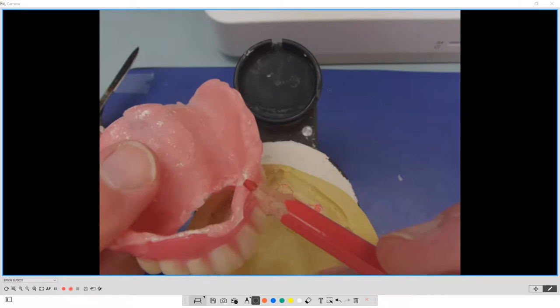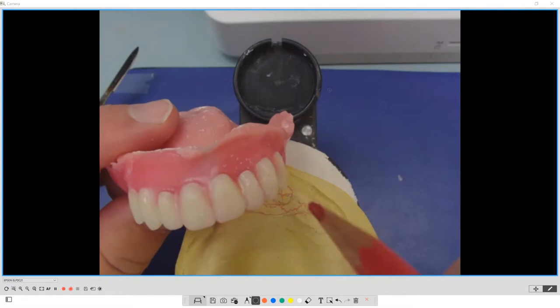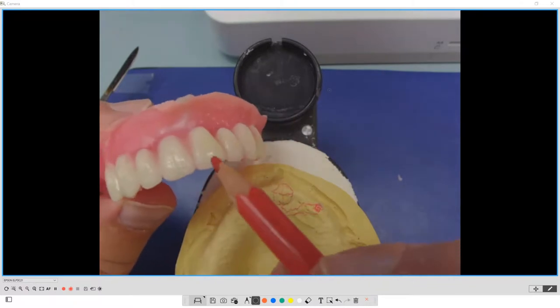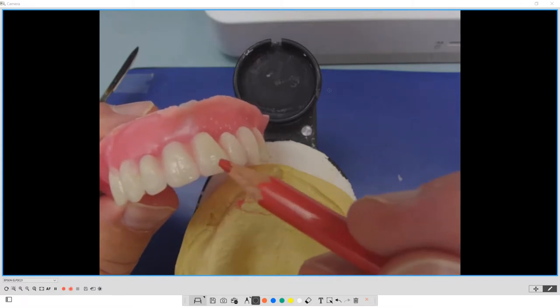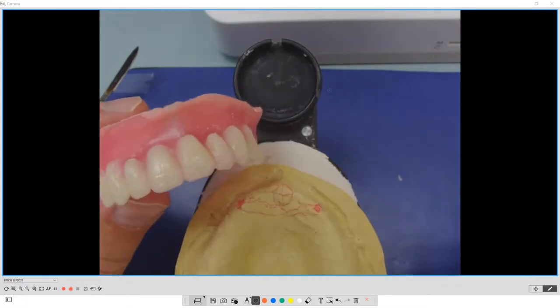So we can actually use the teeth to push the lip more forward on those types of cases, yet do it without making it look Bucky Beaverish, so that we can just change how we're positioning this incisal edge on the wet and dry line of the lower lip. So I'm cheating a little bit and I'm just trying to push it a little forward on the wet and dry line of the lower lip, using the teeth to pull and push out the lips so that this isn't as bulky or doesn't need to be necessarily as bulky.